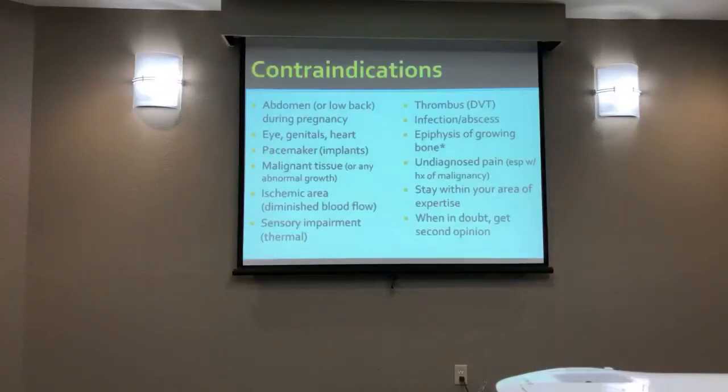I'm a hand therapist, and I tell my patients, we're gonna try this, I'm not sure it's gonna work. How many times we do this will depend on how it feels. And whether it's a placebo effect or not, people do say they feel better after the treatment. Lateral epicondylitis, De Quervain's, trigger finger, those are the main conditions I use it for. I encounter a lot of people in this type of setting who say the same thing.